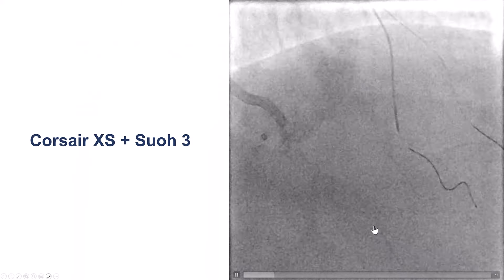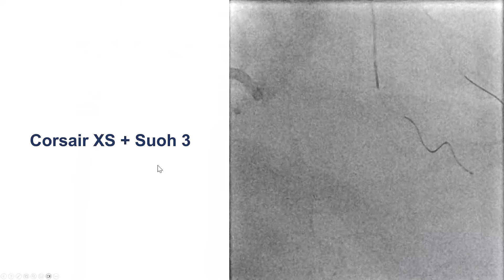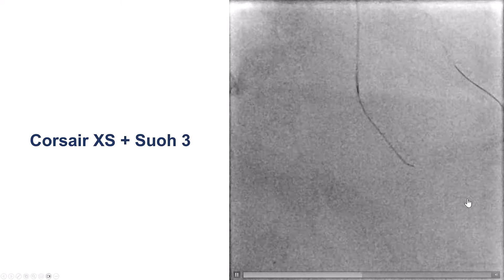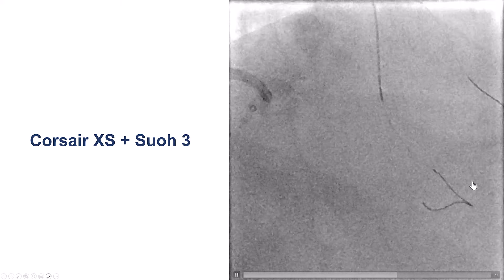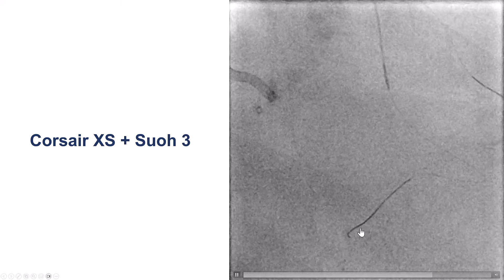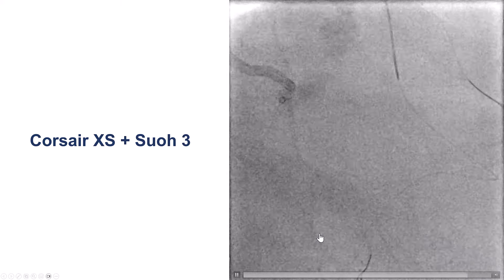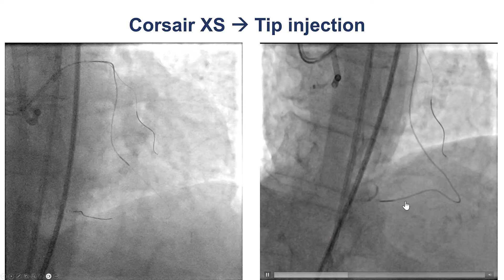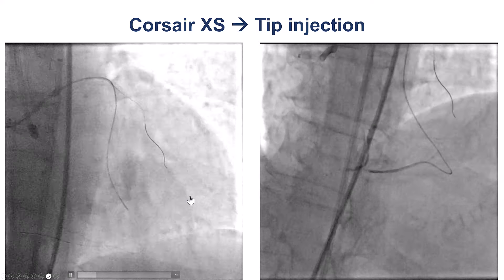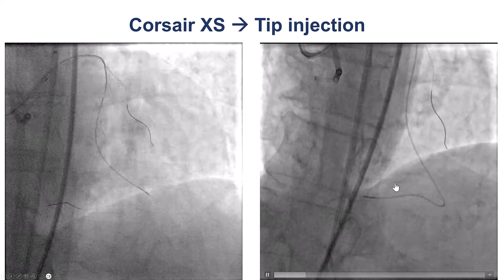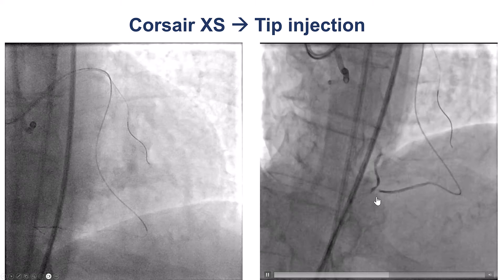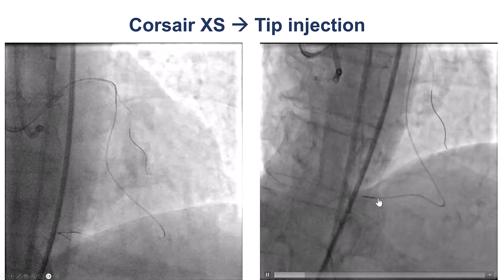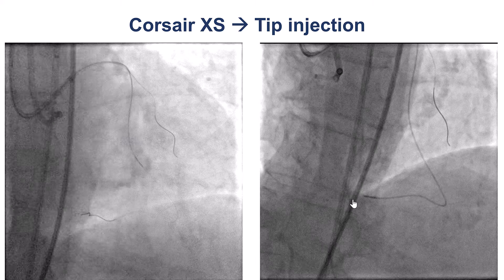We tried with different wires — the SUO 03 through a Corsair XS. The wire went in different locations, but eventually took the bend and advanced nicely across the course of the RCA, confirmed with contralateral injection. We then delivered the microcatheter and did a tip injection showing a little filling of the distal right coronary artery.